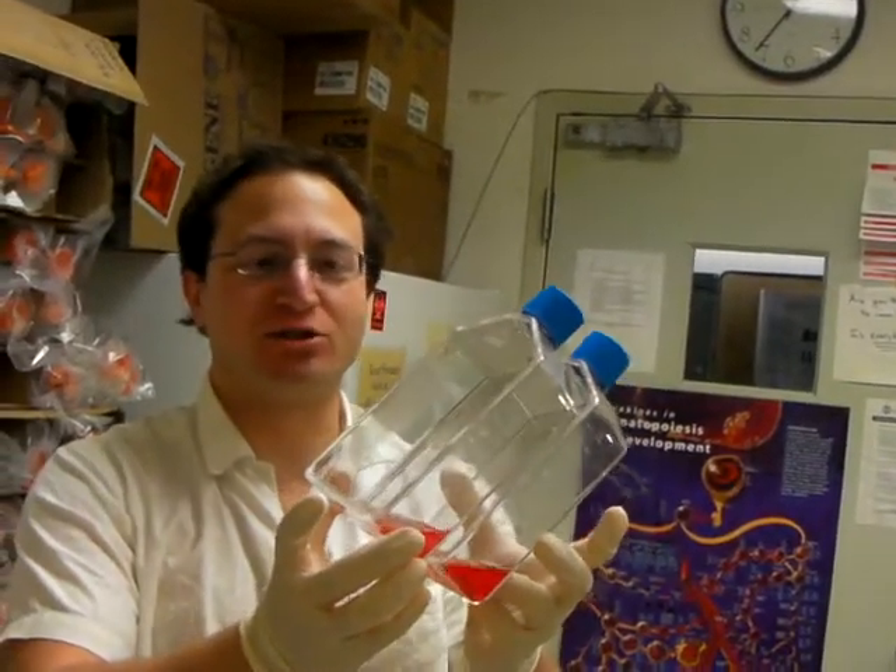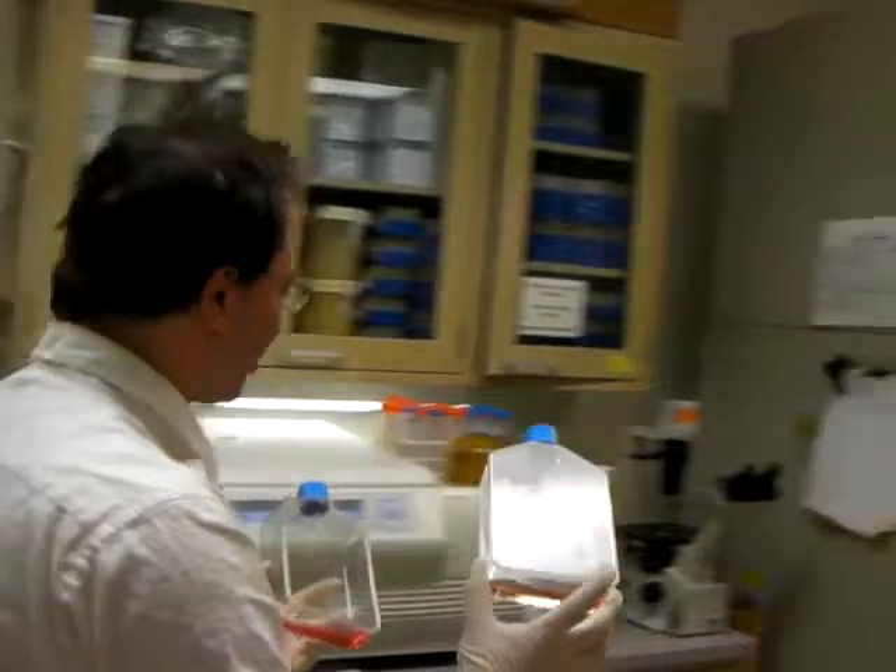These are our flasks — T175s. That's 175 centimeters squared of surface area.